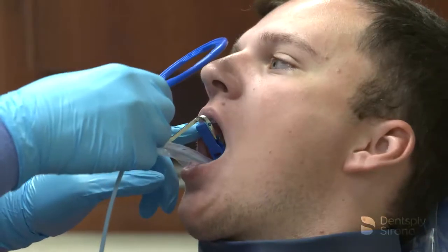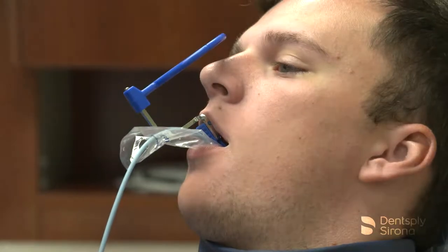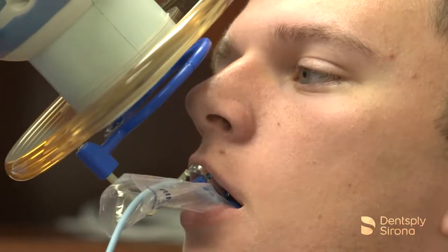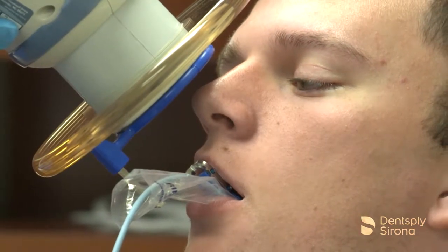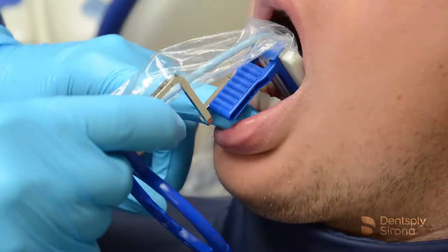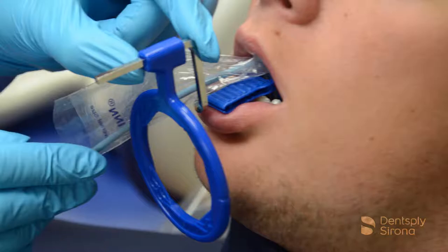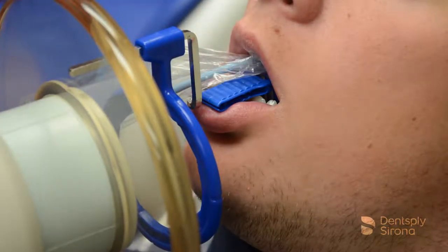To capture maxillary images using the XCP short arm aiming device, center the bite block behind the maxillary anterior teeth being captured and rest the bite block from the incisal edges. Instruct the patient to close slowly and align the handheld portable x-ray device to the aiming ring. The image is now ready to be captured. Continue capturing images of the mandibular anteriors by positioning the image receptor in the same manner used for the maxillary anteriors. Center it behind the teeth being captured, instruct the patient to close slowly, and align the handheld portable x-ray device.